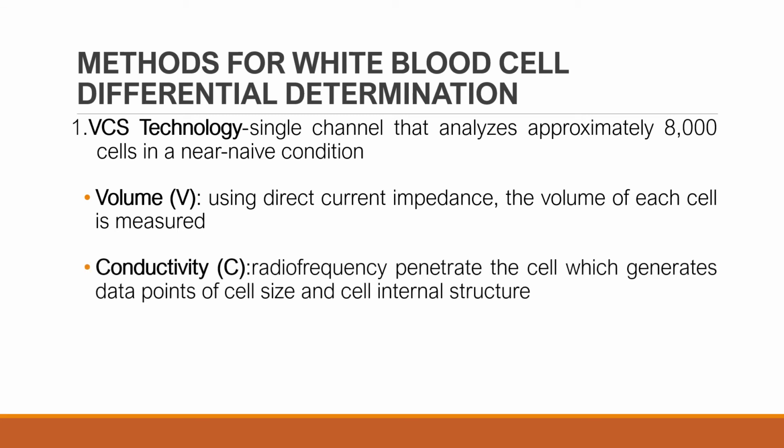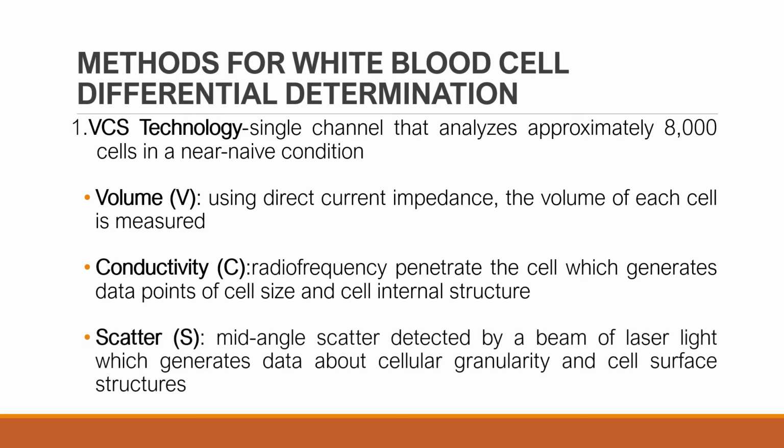Next, C stands for conductivity. Radio frequency penetrates the cell, generating data points for the cell size and cell internal structure. And S stands for scatter, which makes use of a mid-angle scatter detected by a beam of laser light, generating data about cellular granularity and cell surface structures.